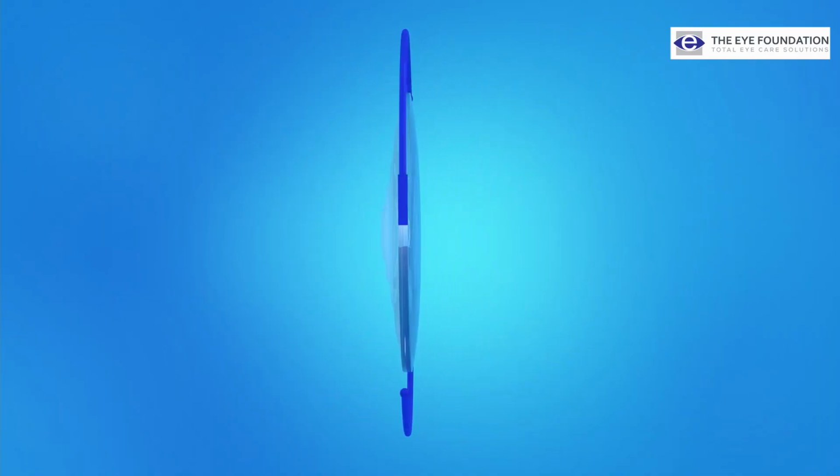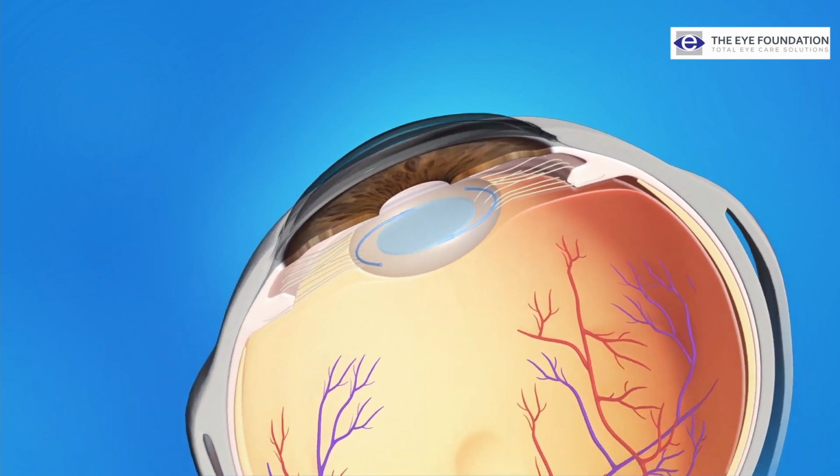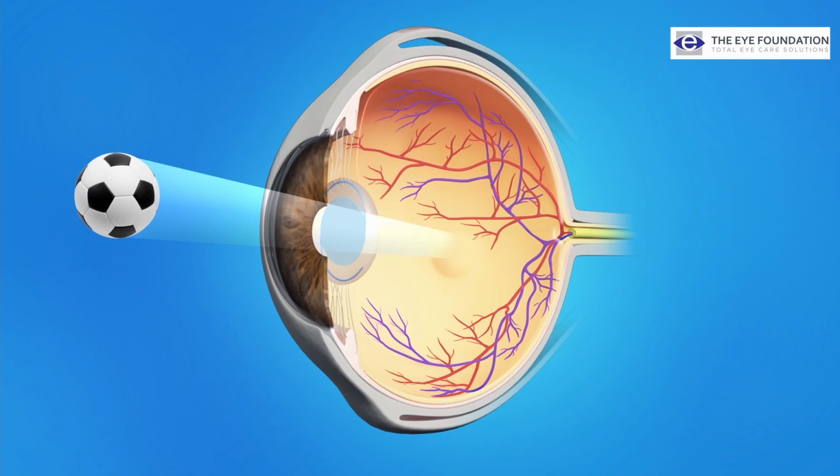Next comes the multifocal lens. These lenses mimic the natural lens which is present inside the eye. It has the ability to flex, and these lenses can be useful for three distances: far, intermediate and near vision. So it's up to you to discuss with the doctor, and based on the patient's requirements, these lenses can be implanted in your eye.